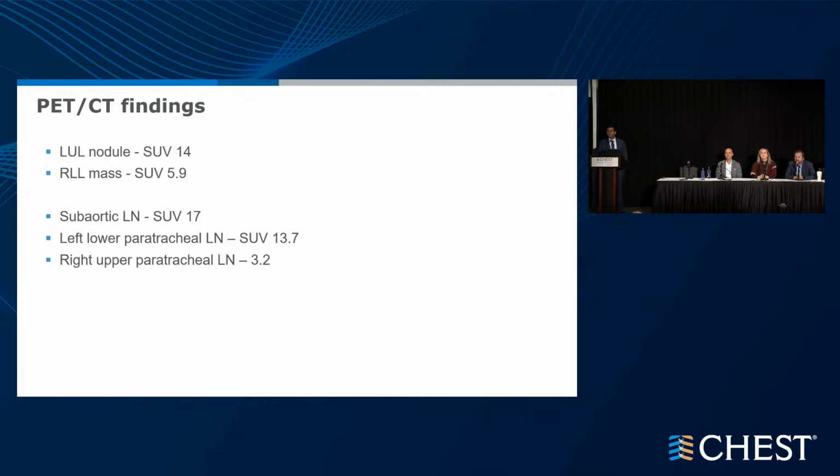I'll try to find an old CT scan, especially if it's done recently, to see if the right lower lobe lesion is altogether new and inflammatory in nature. That would help us a lot, especially if it was done, let's say, 2 months ago and it's all there. It may be more inflammatory in nature, and we may have the culprit mainly in the left lung. Sure. Yeah. You're saying you're being a doctor, not just a proceduralist?